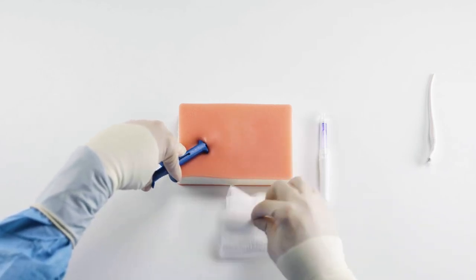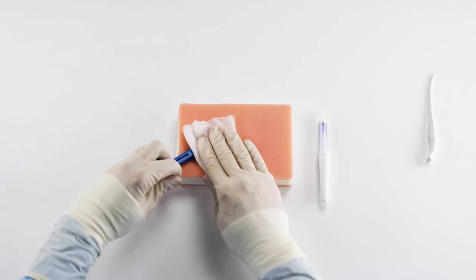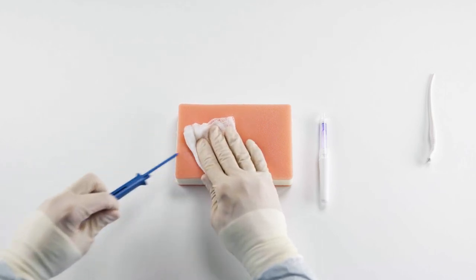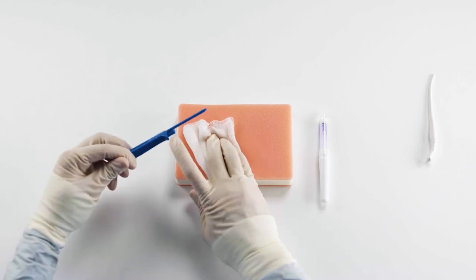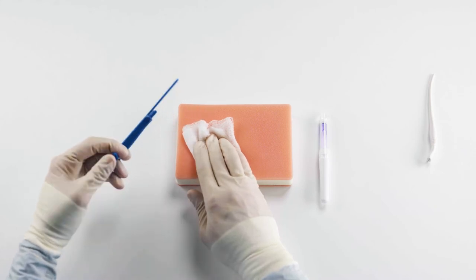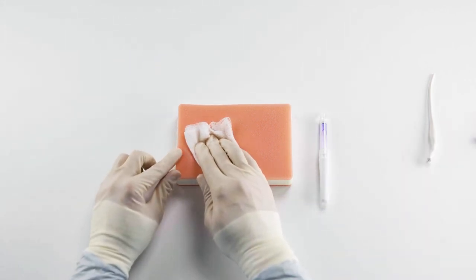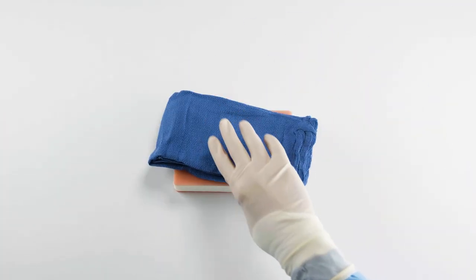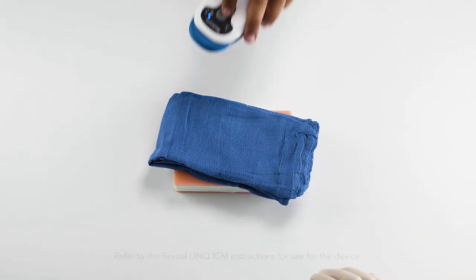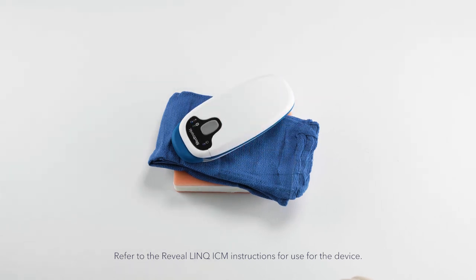I'm now going to take a 4x4, provide pressure, and with my left hand remove both tools at the same time. The Medtronic Reveal Link has been inserted approximately 10 millimeters away from the incision, so you can be reassured that the device will not pop out easily. I'm going to hold pressure here for a moment to ensure bleeding is controlled. Prior to closing the incision, I'm going to apply a sterile towel on the patient's chest, and a team member will apply the Medtronic reader head onto the patient's chest to ensure the R-waves are above 0.2 millivolts.